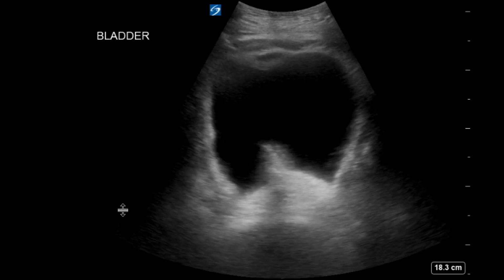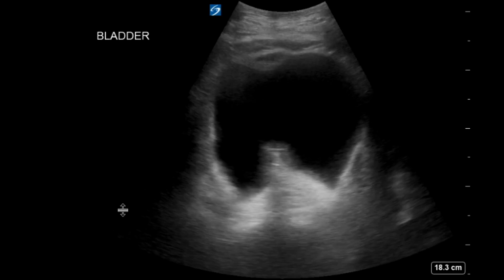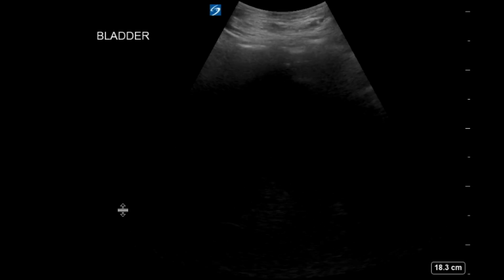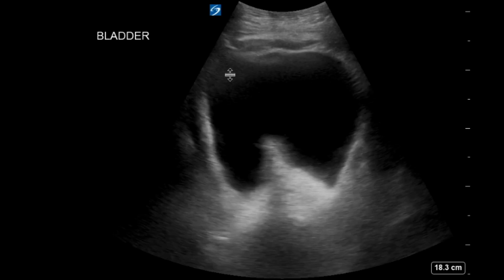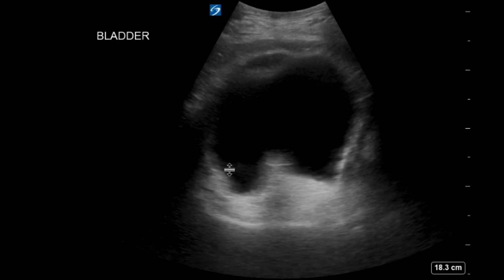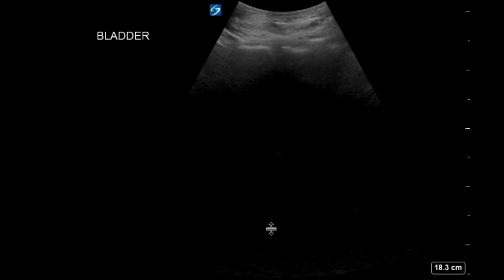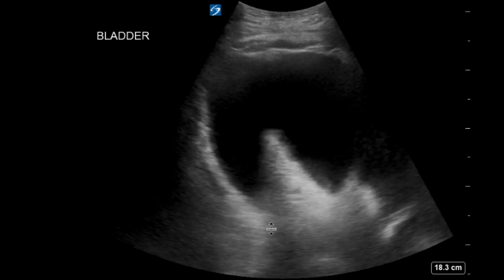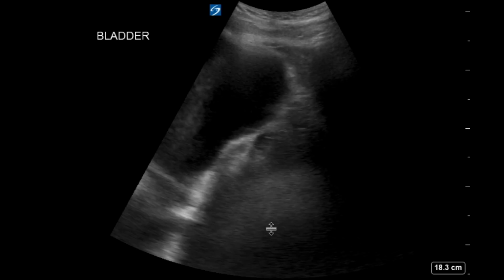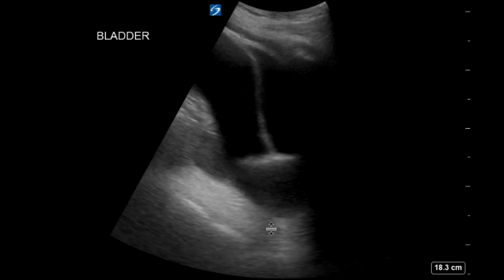Let's go down to the bladder now. It kind of looks like there's two bladders in this situation, right? Yeah. So it's hard to tell just based on a couple of views which one is actually the bladder. I think the one at this position here is probably the bladder, and then down here you see probably some bowel loops in ascites fluid that sort of looks like the bladder. Okay. But we know that's definitely abnormal. And then they're doing a longitudinal view of the same thing. We see two bladder-looking structures, which we know is not possible, so it's likely consistent with that continued free fluid.